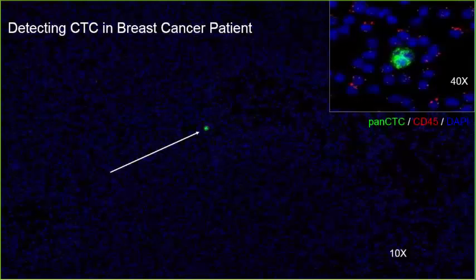Whereas the last two examples employed a chromogenic RNAscope assay, this image is an example of a multiplex fluorescent assay, but using only 2 channels rather than our current maximum capability of 4. Alternatively, 3 RNA markers and 1 IHC marker can be interrogated.